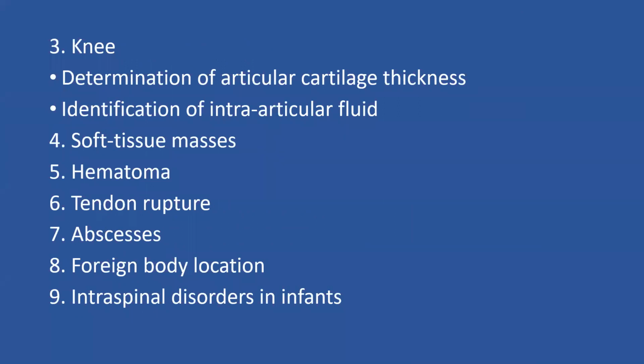In the knee, determination of articular cartilage thickness and identification of intra-articular fluid. It helps in soft tissue masses, hematomas, tendon ruptures, abscesses, foreign body location, and intraspinal disorders in infants.